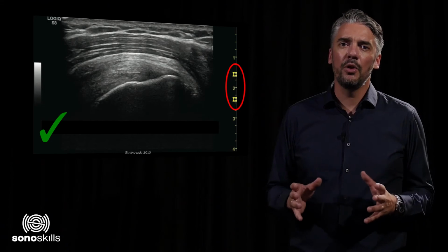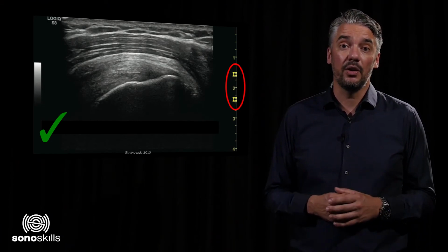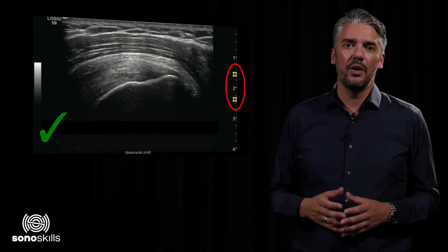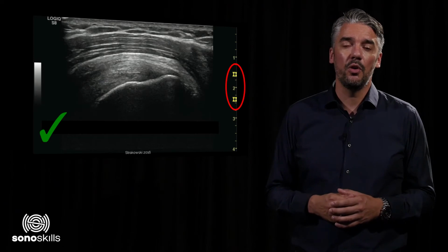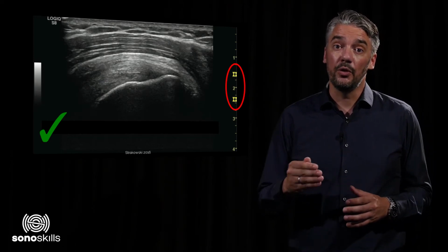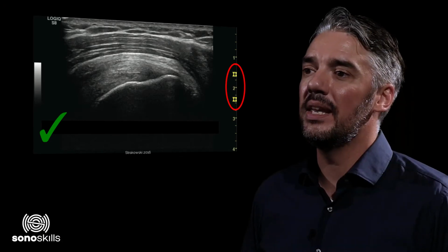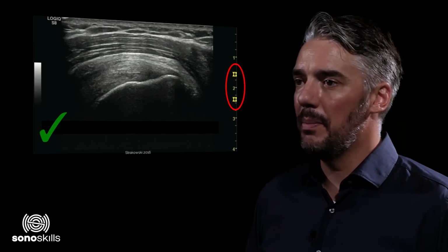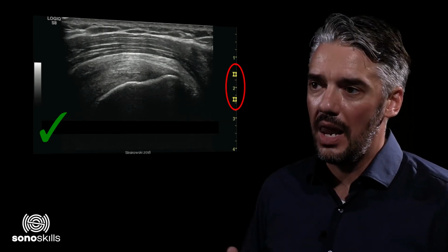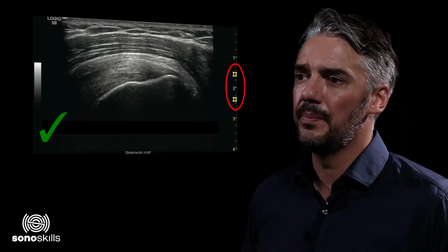However, the focal point will correspond approximately to the deepest part of the Fresnel zone, and as such, any part of the image deep to the focal point will lie within the Fraunhofer zone with associated beam divergence and poor resolution. Consequently, much better results will be achieved by placing the focal point roughly leveled with the deepest part of the structure to be examined.